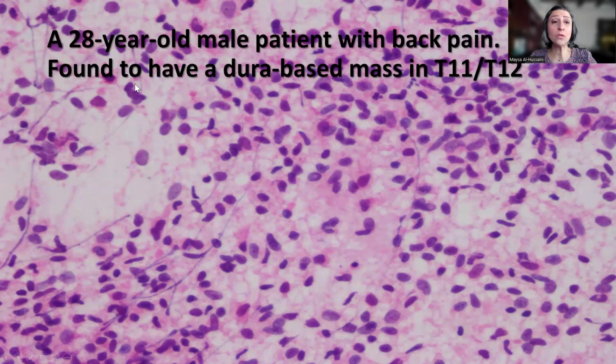And as you can see, this is a cellular tumor, and there is a proliferation of oval-shaped cells with a tendency sometimes at spindling, with minimal pleomorphism, not much in the way of mitosis or necrosis, and some eosinophilic granular material in the background.